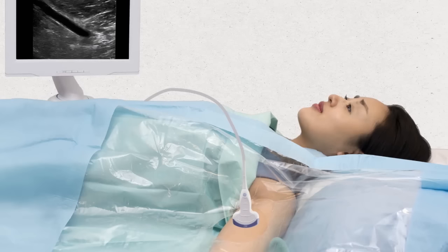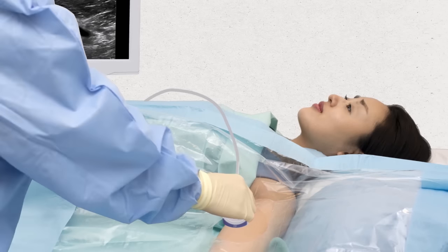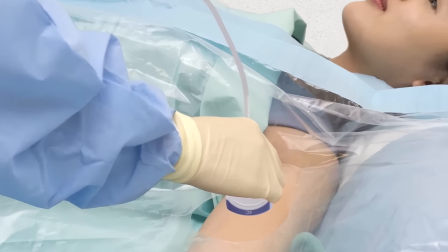An ultrasound scanner is then used to help assess the most suitable vein for insertion of the PIC. The sensor may feel cold against your skin, but the scan is painless.